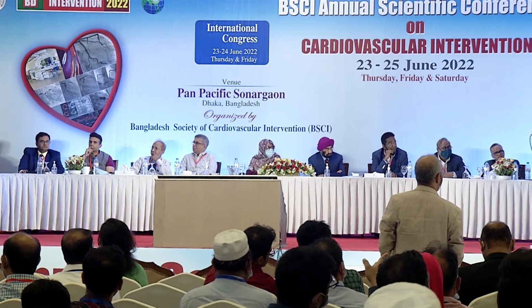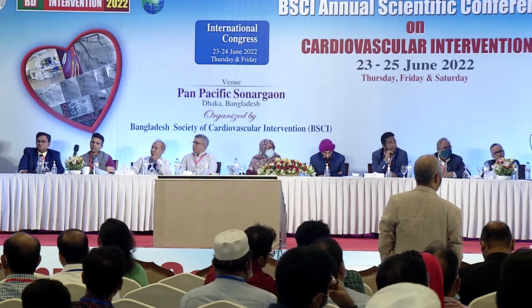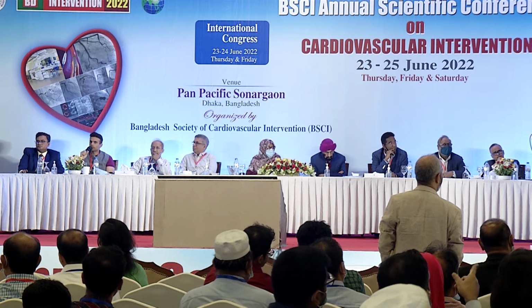I do agree with you, but you know, the edge dissection is better seen by the OCT. As we have taken a 4 diameter stent and the distal vessel is 3.9, over-dilatation is there. So I like to see whether there is distal edge dissection or not, and that is why I have taken OCT rather than IVUS. But to me, IVUS is the best in this case.